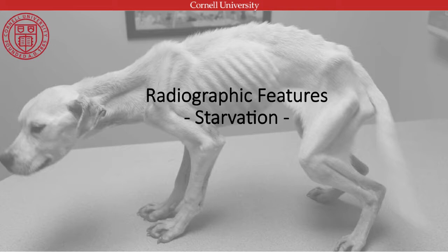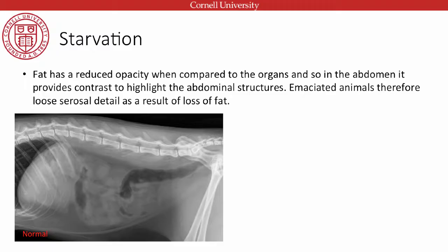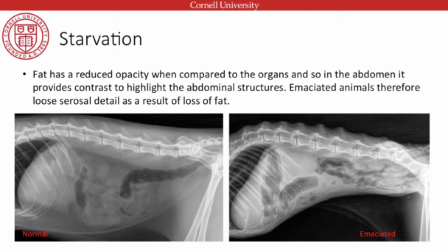I'm going to go through radiographic features of different cases we might see in abuse and neglect. The first is starvation. Fat has a reduced opacity compared to organs in the abdomen. In a normal dog we have a visible renal silhouette, liver, and loops of intestine. When fat is lost due to starvation, we get loss of serosal detail — the margins between intestines and adjacent organs disappear. These animals also have a tucked-up abdomen, a concave appearance, which is important because loss of serosal detail can occur for other reasons.